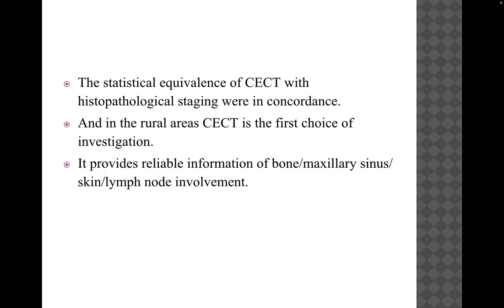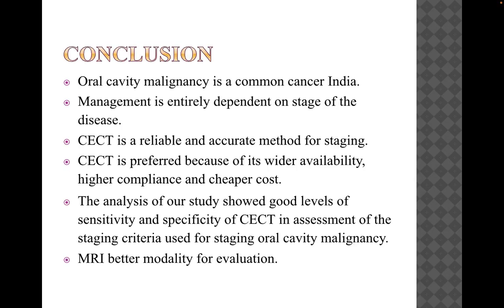The evaluation of CECT with histopathological staging was in concordance, and in rural areas, CECT is the first choice of investigation. It provides reliable information on bone, maxillary sinus, skin, and lymph node involvement.